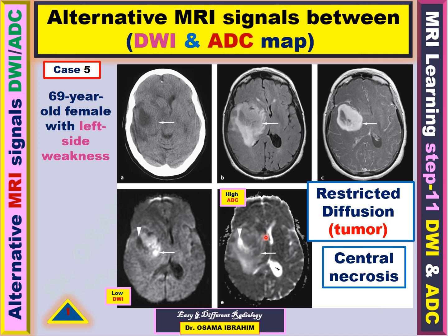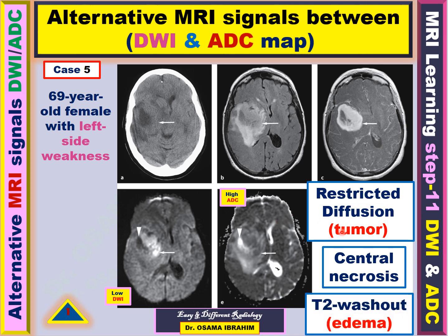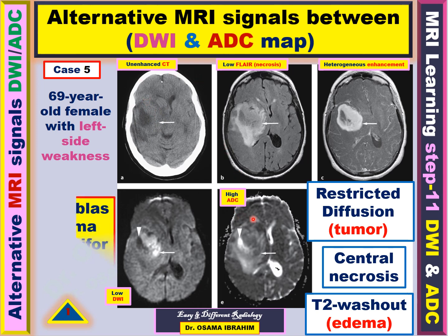The tumor tissue itself appeared high signal in diffusion and low signal in ADC map, representing restricted diffusion. The surrounding tissue appeared high signal in ADC and iso-intense signal in diffusion-weighted image — T2 washout representing edema, shown clearly on the FLAIR image. The lesions appeared heterogeneously enhancing with a central non-enhancing area representing necrosis. CT examination showed heterogeneous density in the unenhanced study. This was a case of glioblastoma multiforme. The lesson here is central necrosis appearing as low signal in diffusion-weighted image and high signal in ADC.